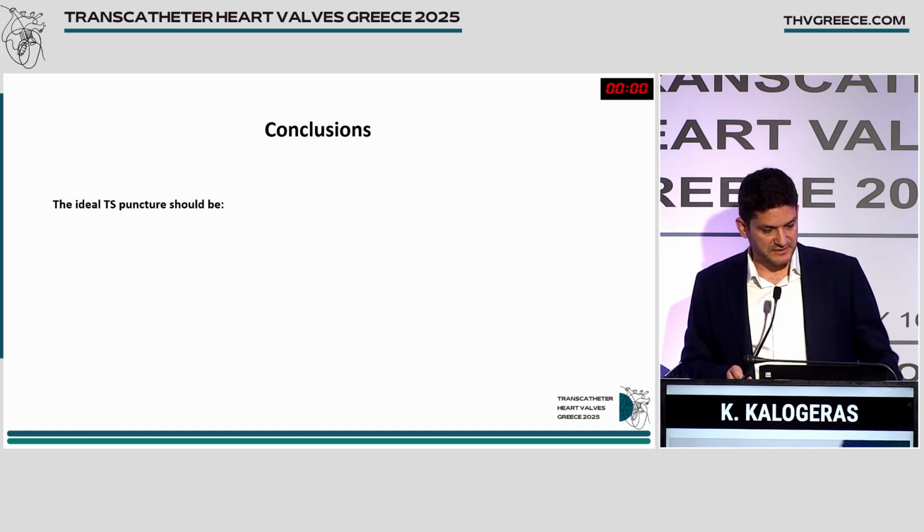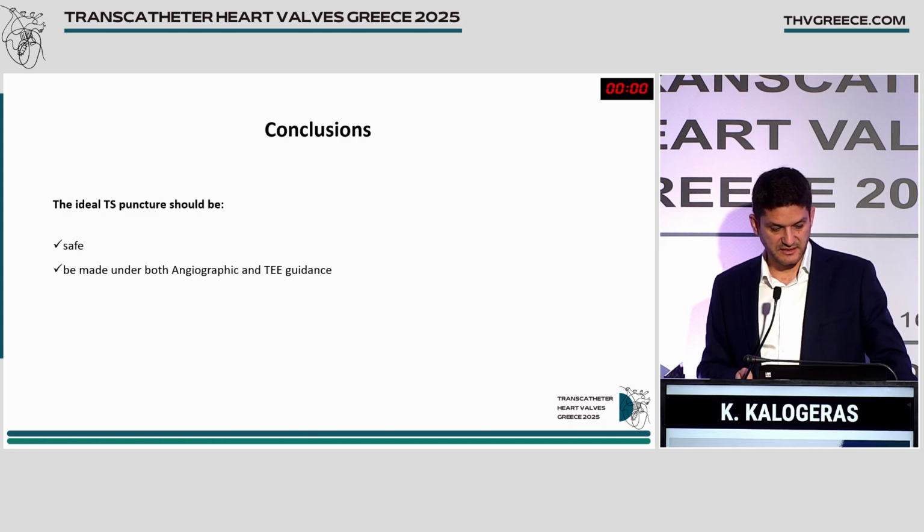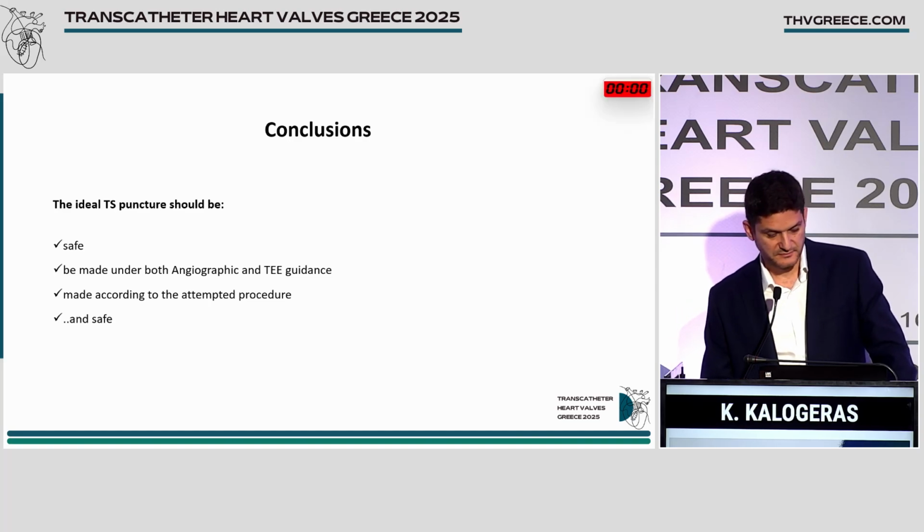So to conclude, the ideal transseptal puncture should be safe, should be made under both angiographic and transesophageal guidance, should be made according to the intended procedure, and should be safe again. Thank you.